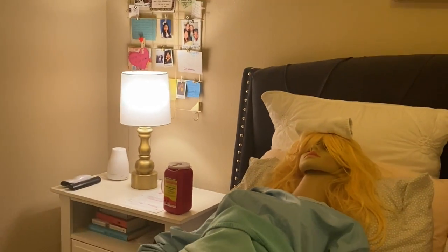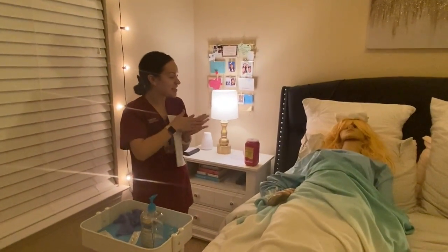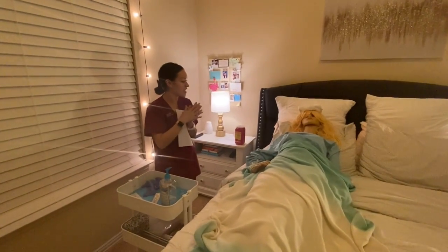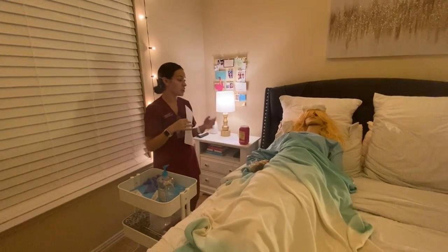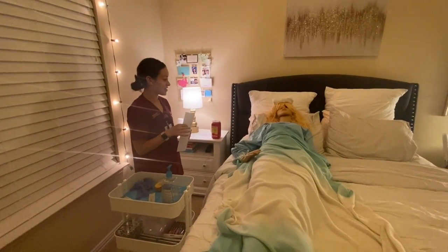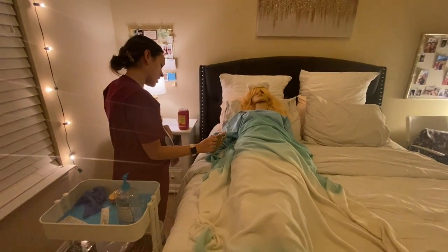Knock, knock. Good morning. How are you doing today? I'm doing great. Thank you for asking. My name is Natalie. I'm a nursing student from TW, and I'm going to be administering your insulin subcutaneously this morning, okay? Okay, great. And can you please confirm your name and date of birth before we begin?